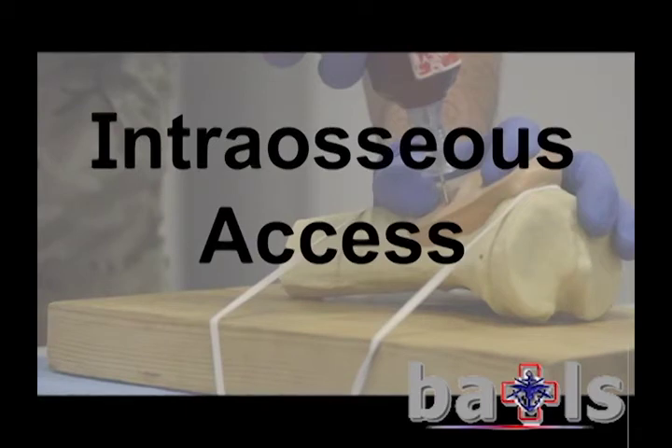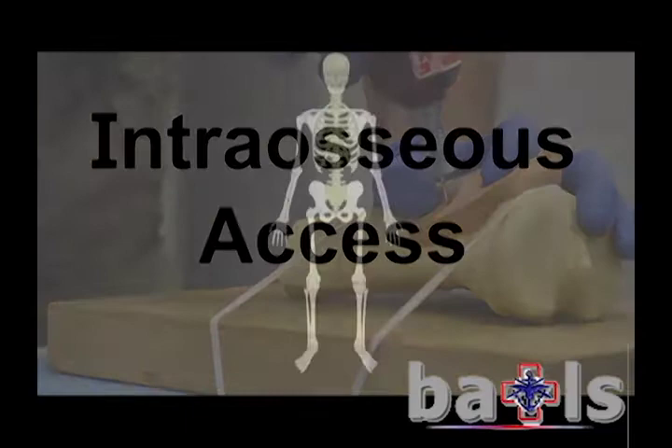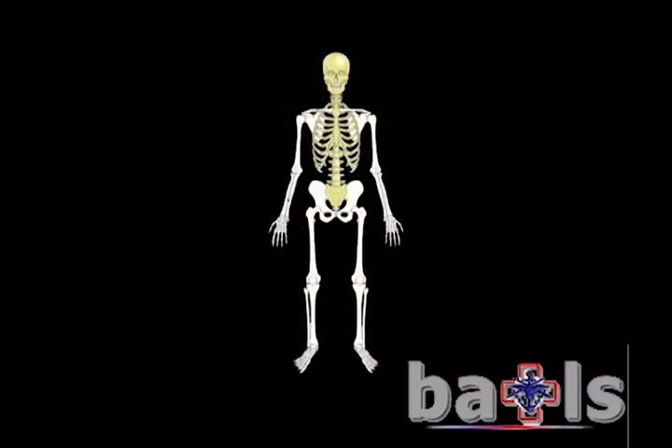This video covers intraosseous access and demonstrates the use of the EZIO device. Practitioners use three sites for IO access: in order, they are the anterior medial aspect of the tibia using the EZIO, the sternum using the FAST, and the head of the humerus using the EZIO.